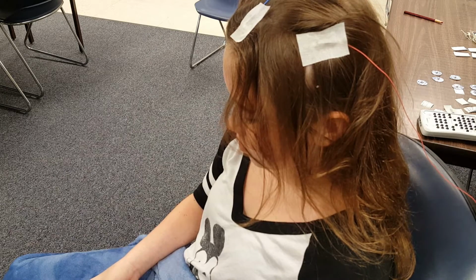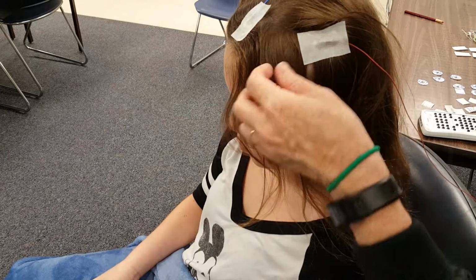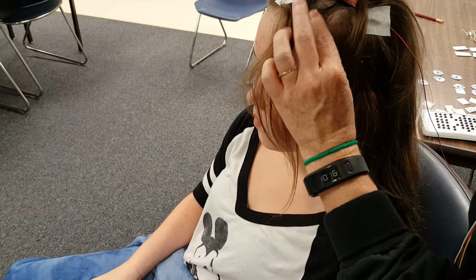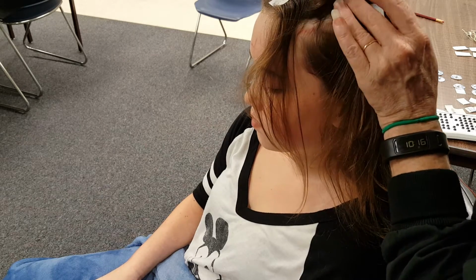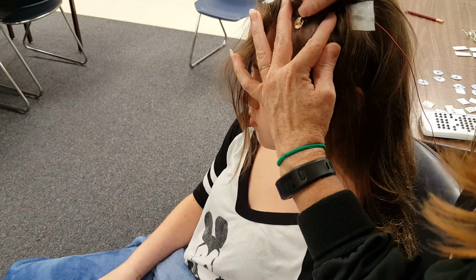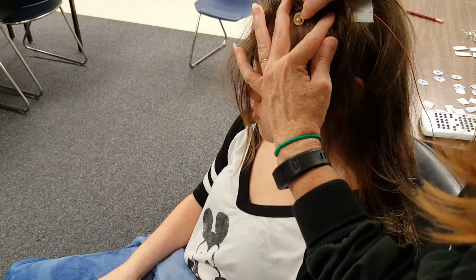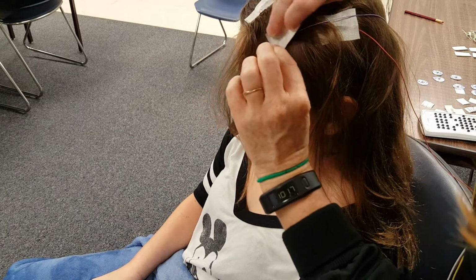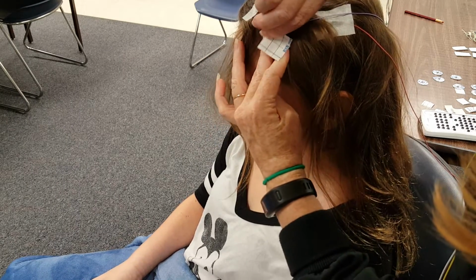We'll do another one here. Again, you're just going to separate the hair, find where you've prepped, which should be right at the intersection of each electrode site. You want to kind of get the hairs out of your way. And then you just firmly press on your electrode. The paste will come out the top. And then if you have your gauze or cover roll, you place it over top.